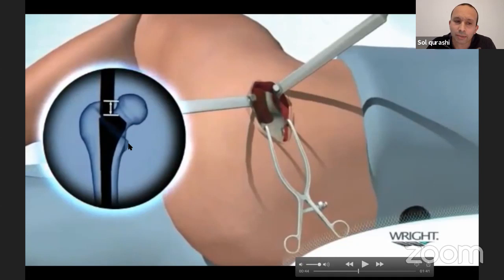So the common landmarks, the broach handle has a marking on it. It's got a ruler on it. That's one thing. But the most reliable one is the saddle, the top of the neck. Can you see my mouse arrow move? Yeah. Okay, yeah. So that's the anterior part of the saddle. You'll see here as well when you're looking at it, you'll see the top of the saddle. Now that is a landmark that you can identify intraoperatively. And obviously you've identified that on your x-rays when you've templated as well. So that's usually a pretty good indicator.